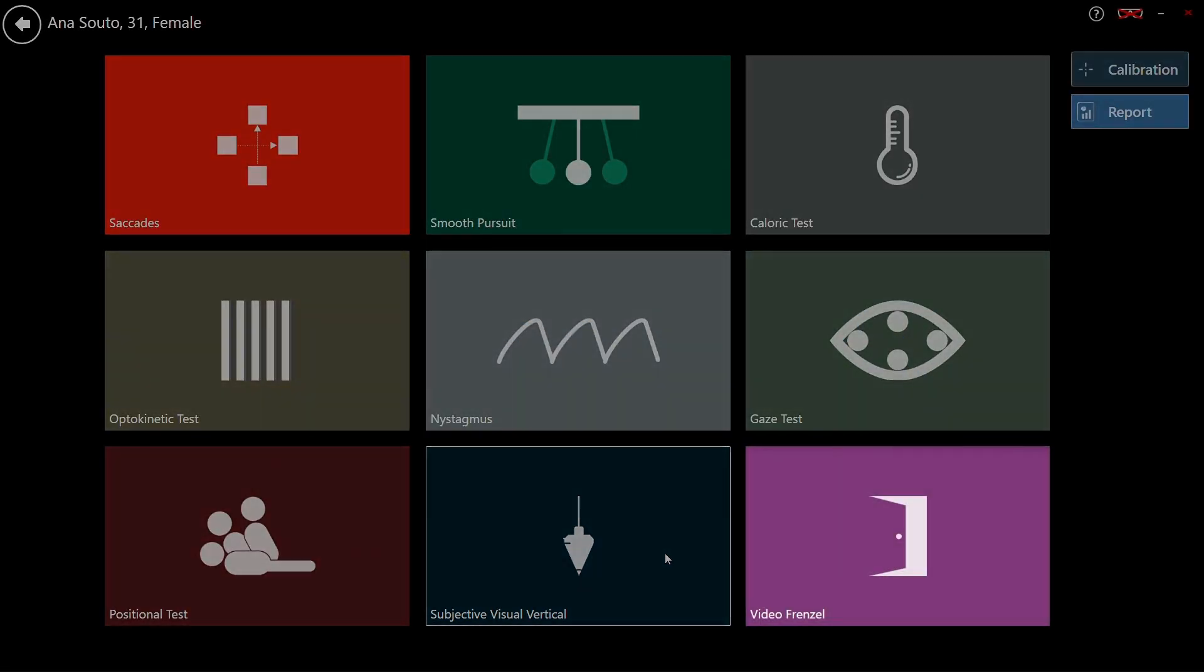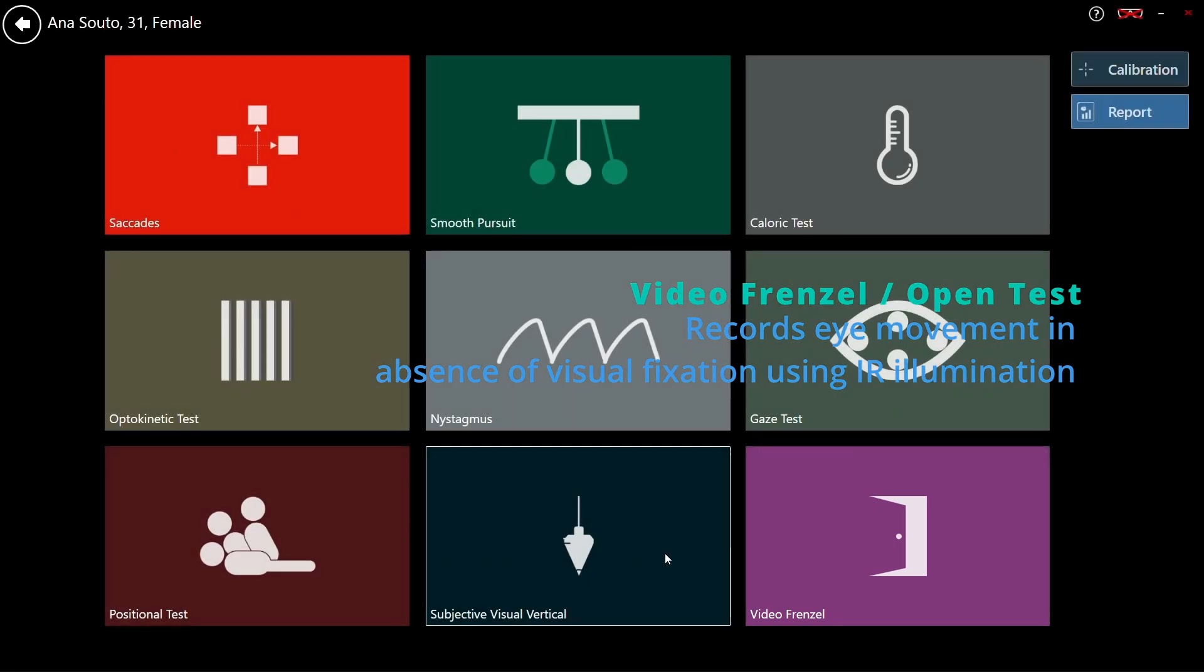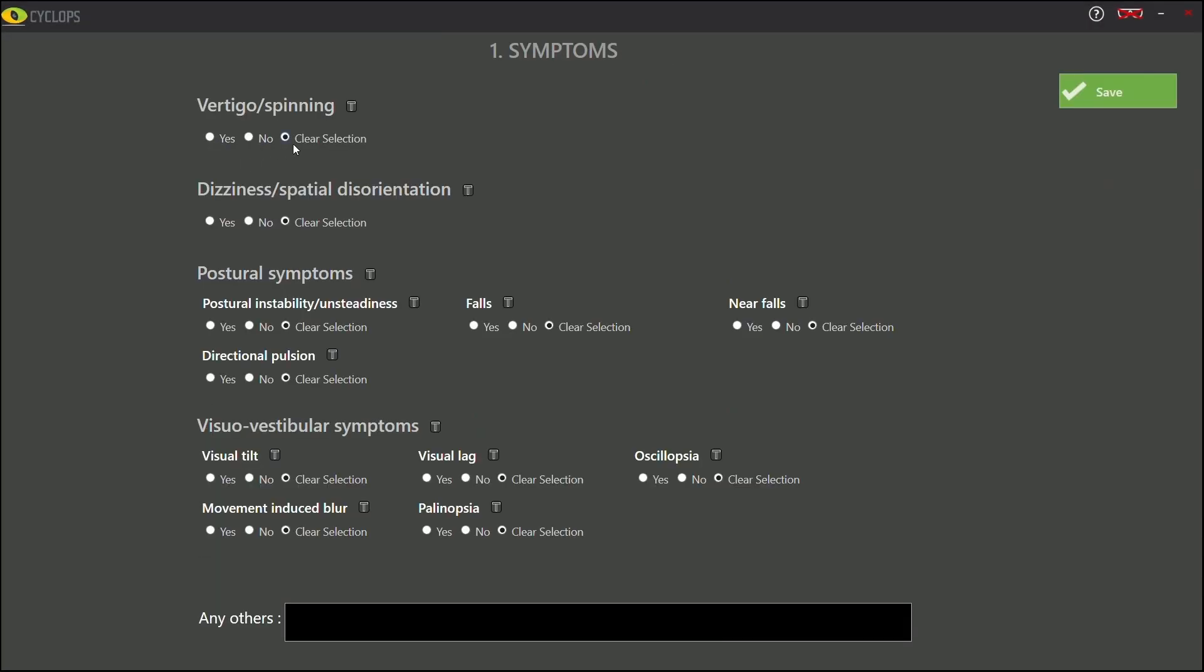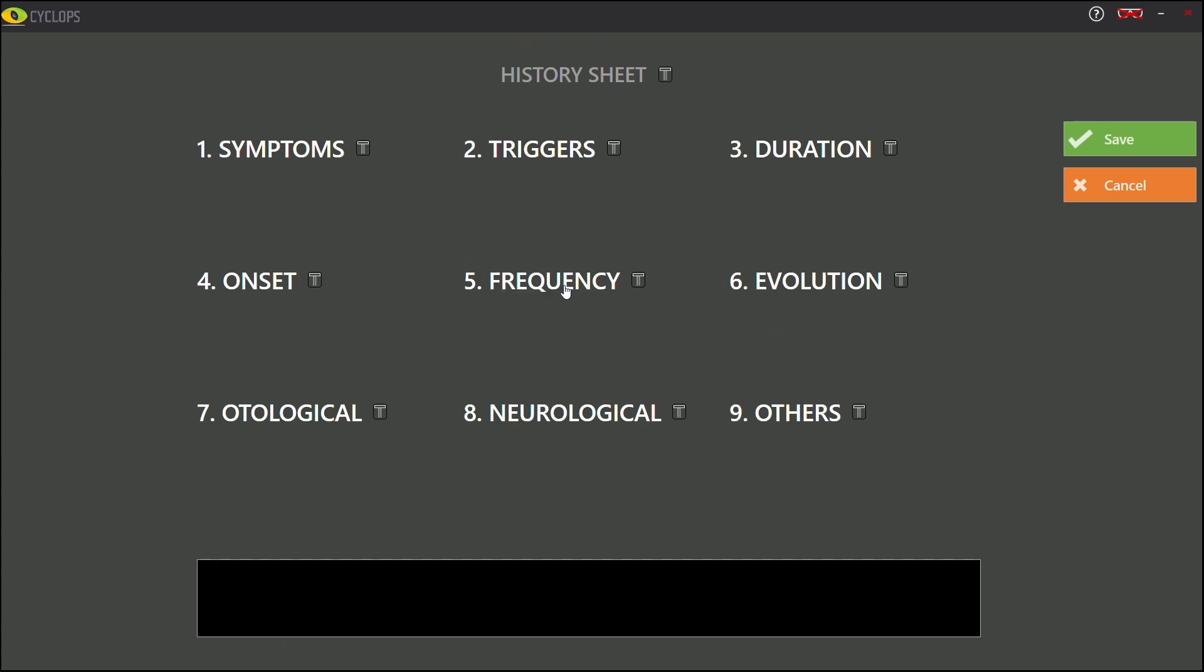Video Frenzel/open test enables observation and recording of spontaneous eye movements without visual fixation. The software is designed for clinical efficiency. Begin with patient registration including symptom history and medical details. During each test results are automatically recorded.